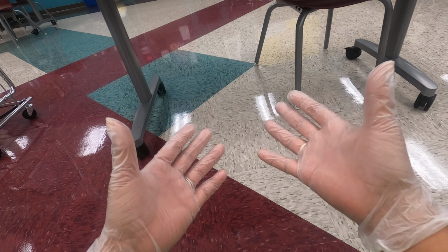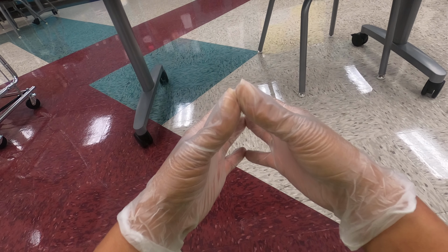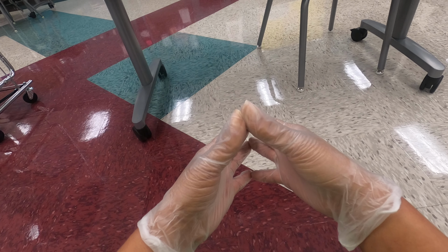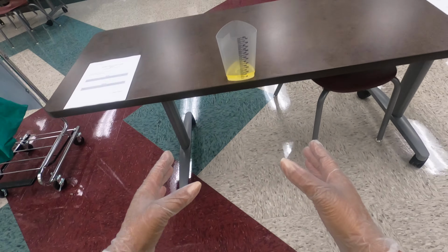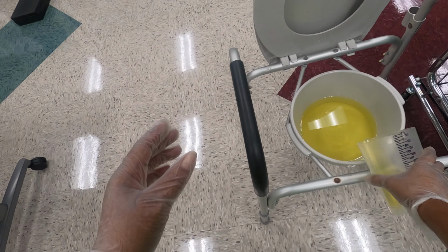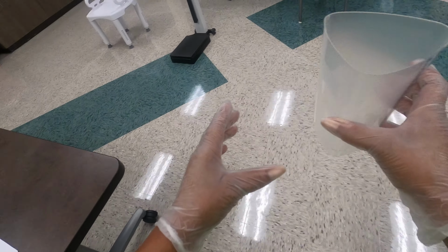You'll want to round up. So for instance, when you measure the urine, if your urine falls between the 150 tick mark and the 175 tick mark, you'll want to record 175, okay? So I'm measuring my urine now. It's 100 mils. So now what I'm going to do is empty the contents of the measuring container into the toilet, making sure it does not splatter or splash.